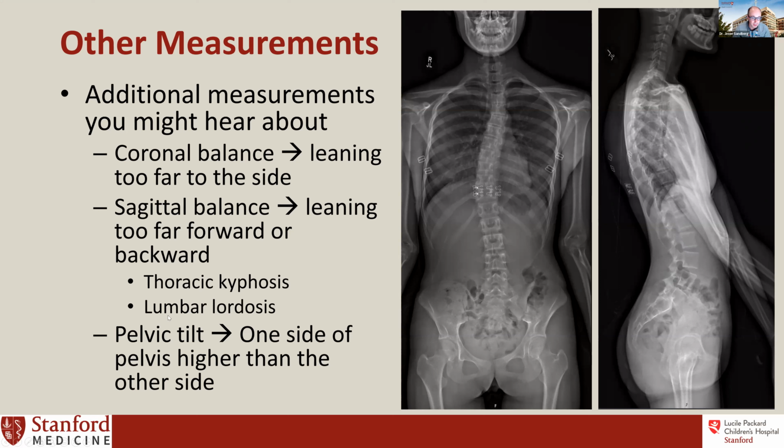And in the lateral, there are all these different medical names. Kyphosis is the curvature of the thoracic spine. Lordosis is the lumbar spine. So sometimes you could also get too much of those, causing issues. But I'll just leave it at that. But I am assessing for that as well.